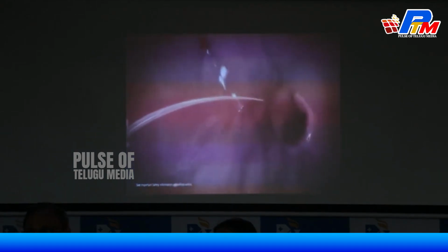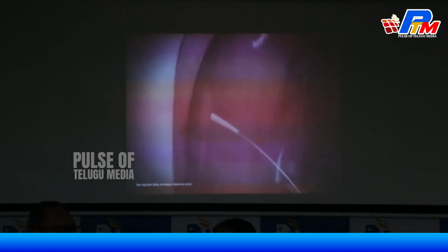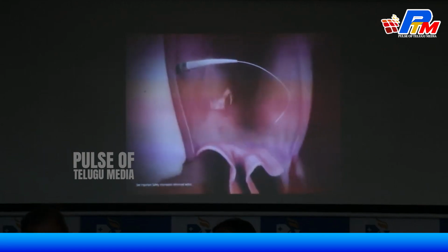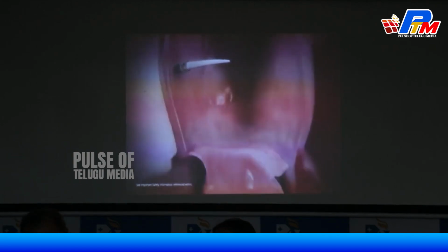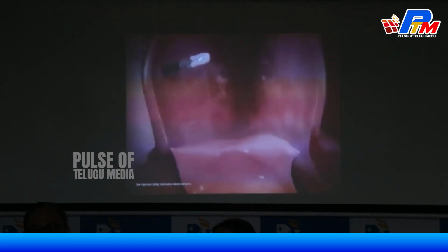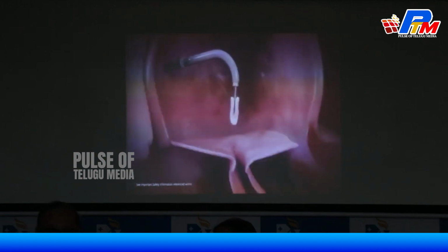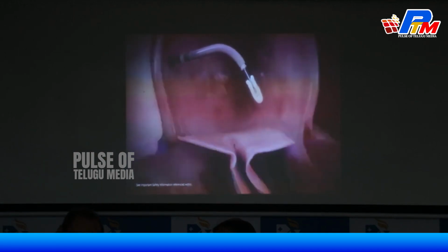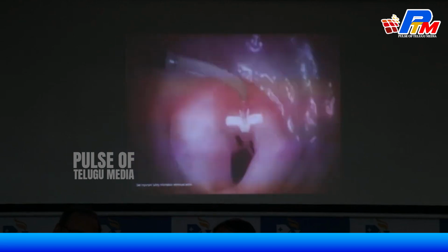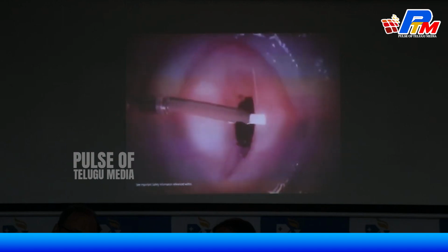We are giving diuretics, we are giving multiple medications, but even after that, these medications are just for symptomatic relief. So for the final treatment, she is 87 years old, and she comes under a very high risk for open heart surgery for mitral valve repair or replacement. We had our heart team discuss regarding this patient and what the possible options are. We did transesophageal echo, and then we finally decided to go for this mitral clip. For this patient, there is a flail prolapse, which is a large area, where we initially tried with one clip.